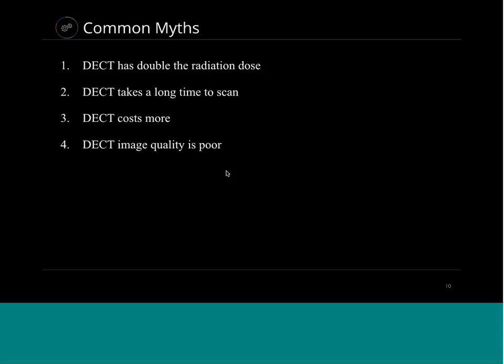Dual energy CT takes a longer time to scan? Not true. It should be roughly about the same as a single energy scan. You guys will give us input on that, whether that's true or not. Love to hear from you. Dual energy CT costs more in terms of the amount that we bill? Not true. In fact, I'll show you that it actually saves society a lot more dollars in terms of the things that we can do with it.